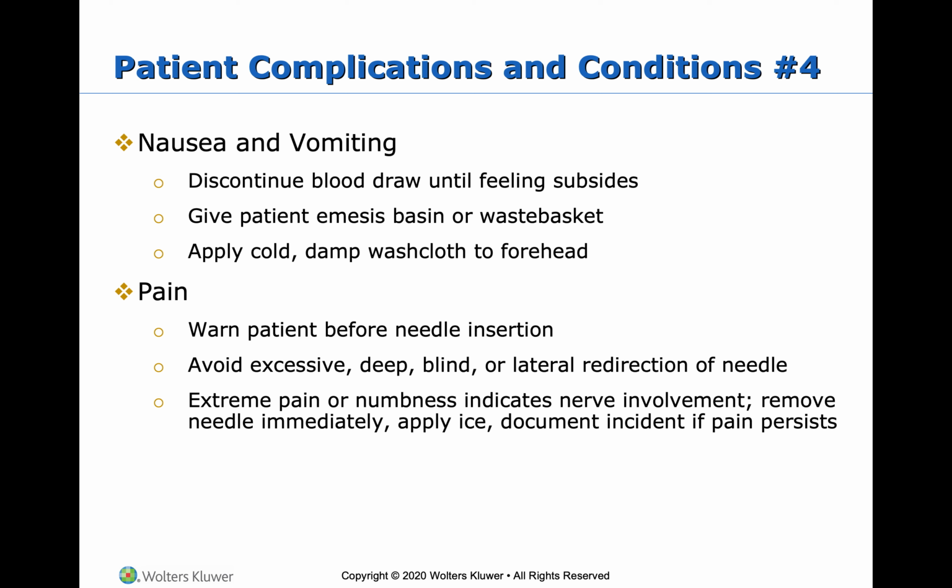So I usually warn the patient right before I stick the needle in. I'll say, okay, here comes a big poke. But some patients, when they come in, will ask you not to tell them, or if a patient is hesitant about the draw, I will ask them if they want me to tell them. The reflex for some people that aren't prepared for a poke is to pull back their arm, and that can pull the needle out of your arm. So it is usually best to prepare the patient unless they ask otherwise.